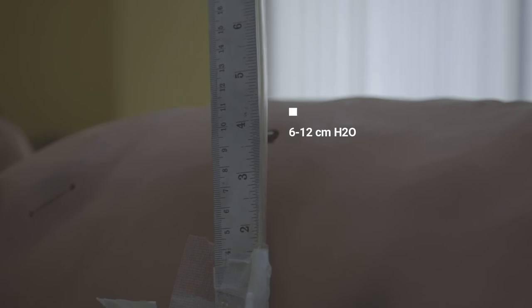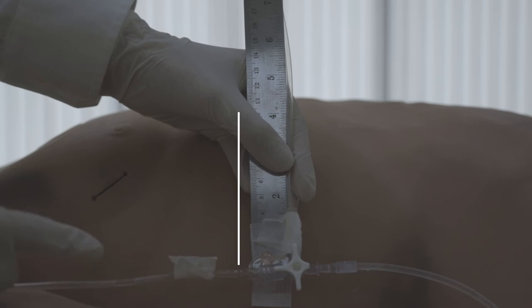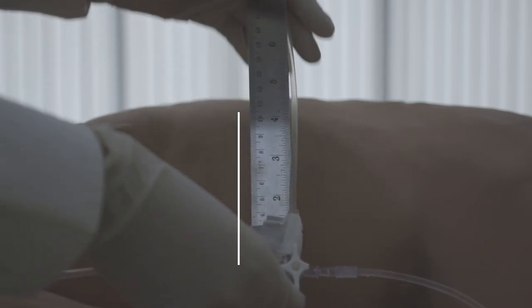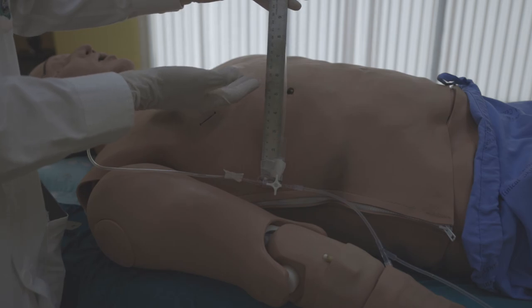Normally, the level of CVP will be around 6 to 12 centimeters of water. When we measure the level of CVP, we measure it at the end of expiration, which will reflect the highest pressure in centimeters of water.